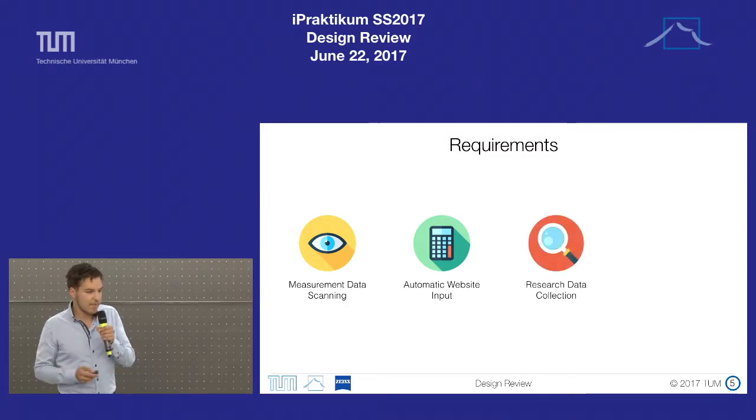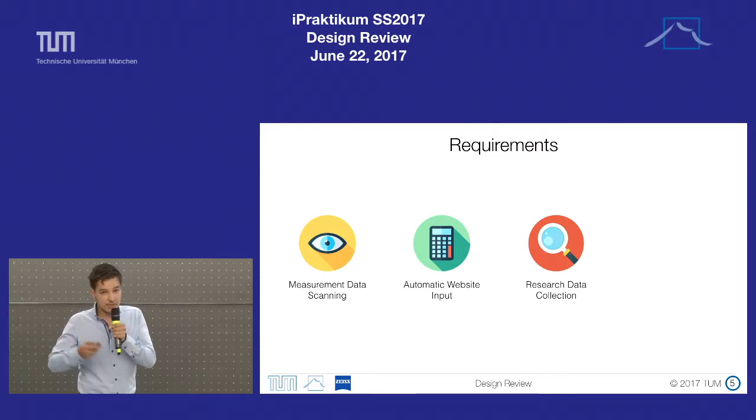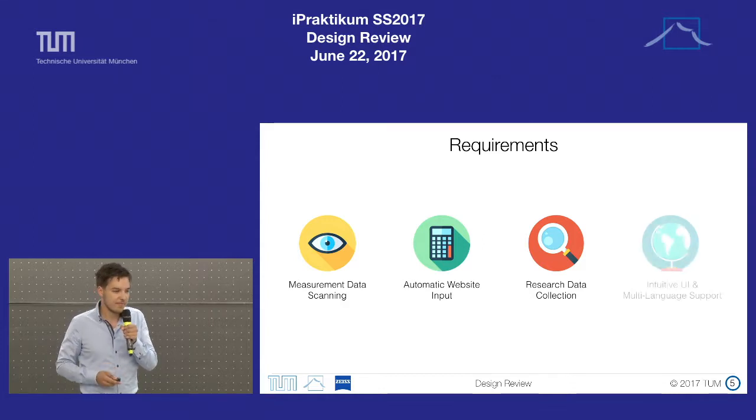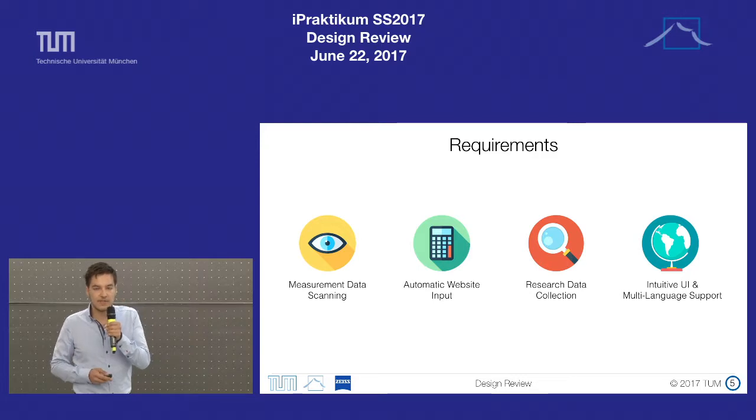Another important requirement is the research data collection. So far, it has not really been possible for ZEISS to evaluate surgery results and rate the performance of their products. But this would be crucial to improve their products even further and also ensure the well-being of the patients. A non-functional requirement that we have is an intuitive UI, so the app should be easy and fun to use. And also it should support multiple languages, because ZEISS plans to roll out the app in international markets.